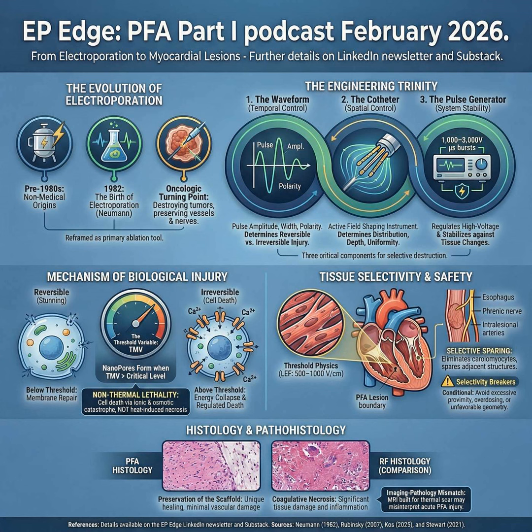But multipolar systems create complex superposition patterns that make results geometry dependent. Positioning and anatomy matter. Now, contact. PFA is less contact dependent than RF because it doesn't rely on resistive heating at an electrode tissue interface, but it's not contact independent. Inadequate contact can still reduce coupling and affect lesion depth and field penetration. And there's an engineering reality people forget. Catheters and cables can distort fast pulses. The waveform at tissue may not perfectly match the generator output.